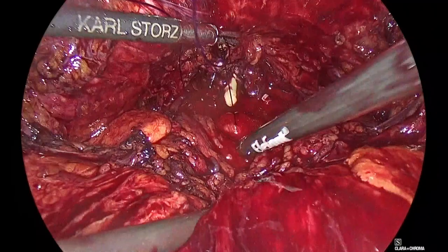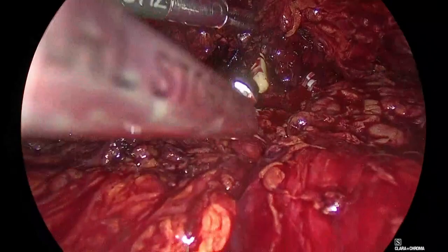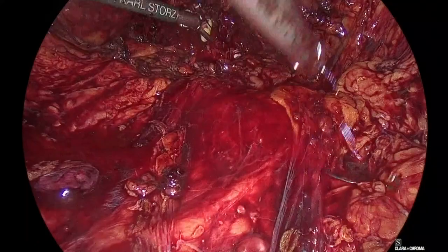Good. We'll check it later. Good. So okay, that's your first needle. So I'll do the posterior layer now. The mucosa, yeah? Catheter in, please.